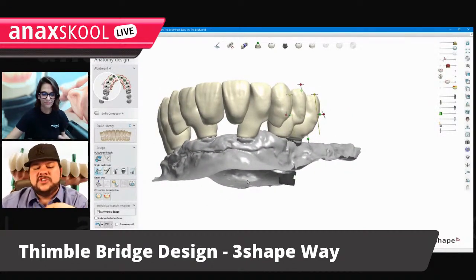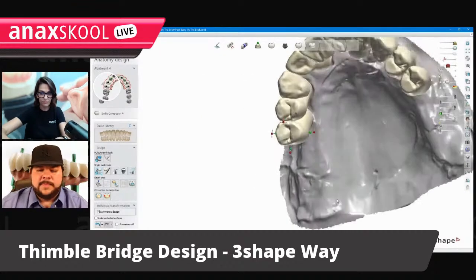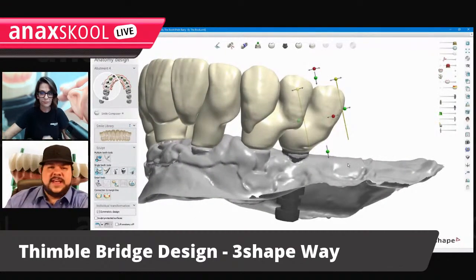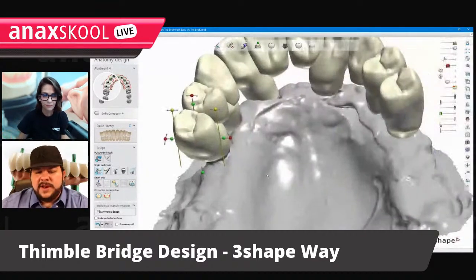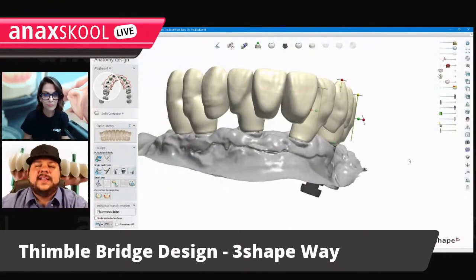It wants you to connect each tooth to the implant before you move forward with the case. Here's the problem. I either got the tooth numbers engaged incorrectly for which implant site, or I didn't know. I didn't have a diagnostic. I don't know what teeth we're doing. You don't know how many, you're doing a full arch. You don't even know how many teeth you're replacing until you set up a diagnostic wax up, until you start gauging these things. So what you have to do now is stretch these teeth over to these little elephant trunk things and then connect them.